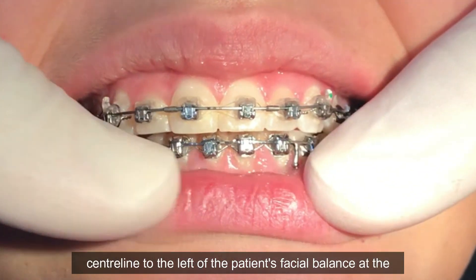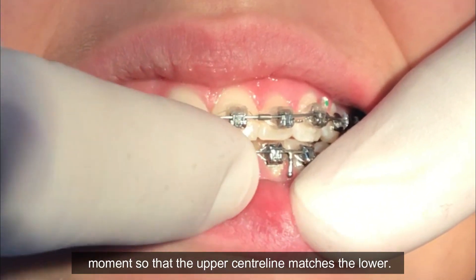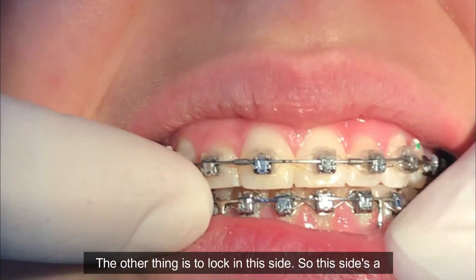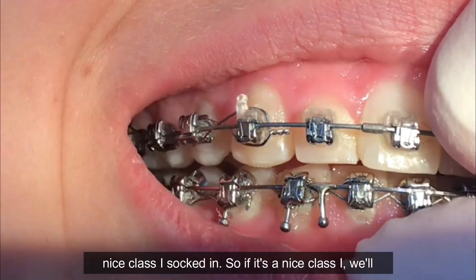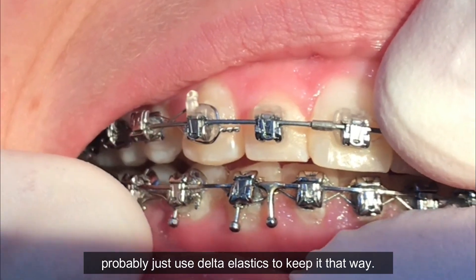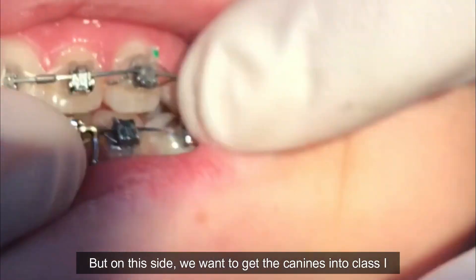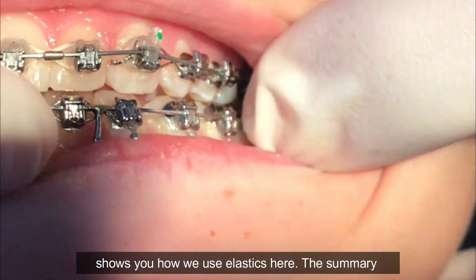The ideal treatment here to get the jaw centered would be to move the upper center line to the left of the patient's facial balance, so that the upper center line matches the lower. The other thing is to lock in this side — it's a nice Class I, socked in — so we'd probably just use Delta elastics to keep it that way.